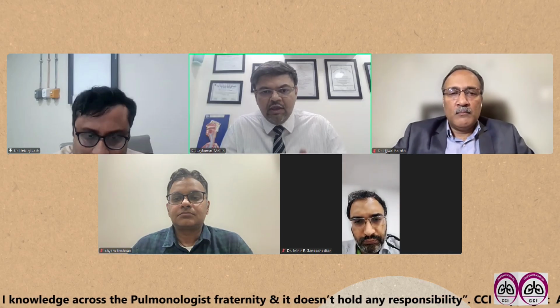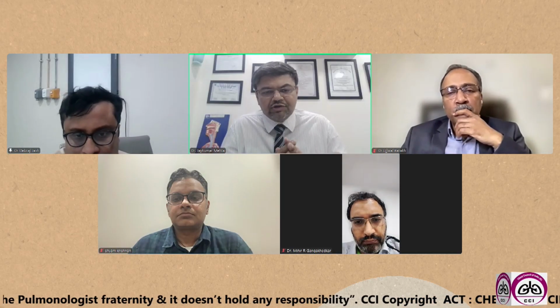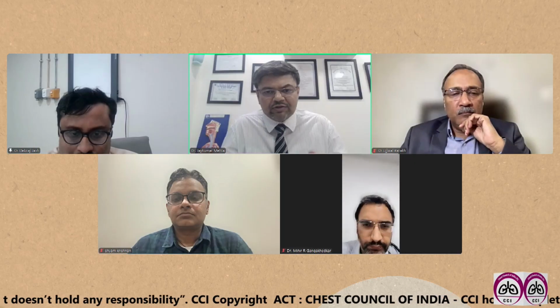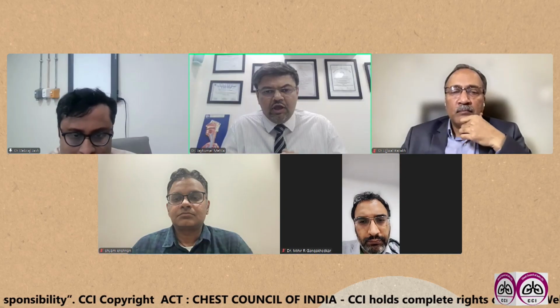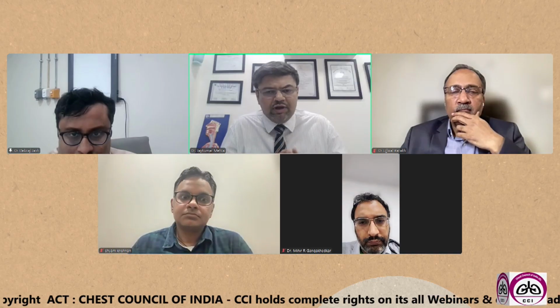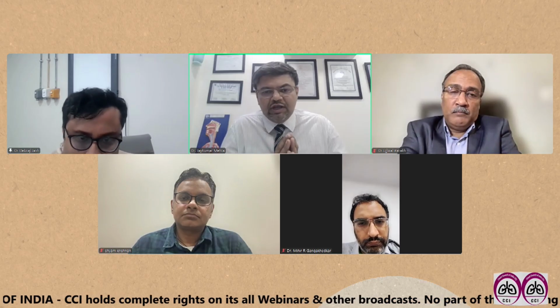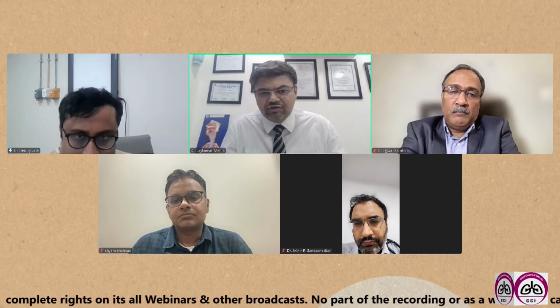For that, where I practice, we have time, infrastructure, availability of anesthetists, sharing of the suite with the endoscopy persons, a plethora of needles, and availability of cryo probes. I usually give a dedicated time of one and up to 1.5 hours to all my EBUS patients, because we need a good and thorough evaluation of almost every aspect. So we need a calm patient with a very well secured airway with LMA. This is our usual practice.